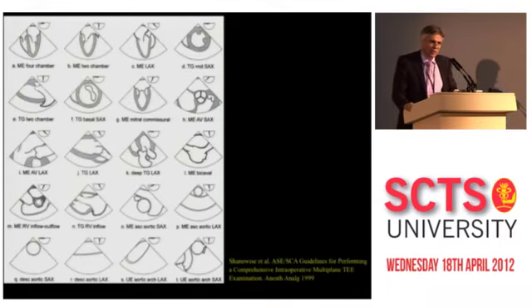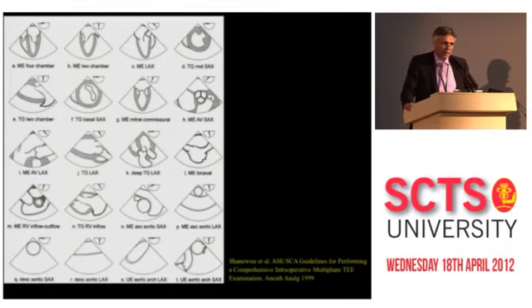TOE is a wonderful tool for assessing cardiac function in the operating room, and most of you will know the guidelines by the American Society of Echocardiography and the Society of Cardiovascular Anesthesiologists. And when you look here at the cross-sectional views that have been proposed by them, you will find approximately 9 or so views that are focusing on the left ventricle, but only a very limited number of views focusing or also focusing on the right ventricle.